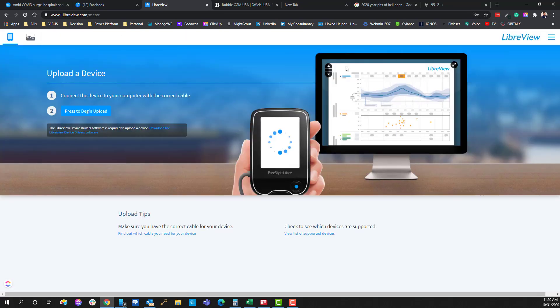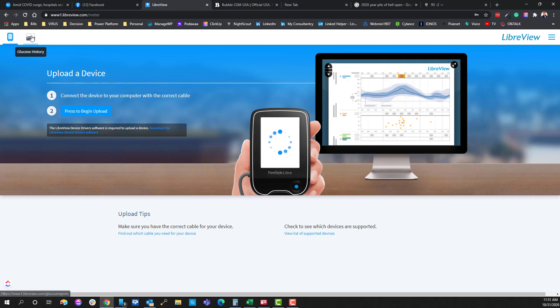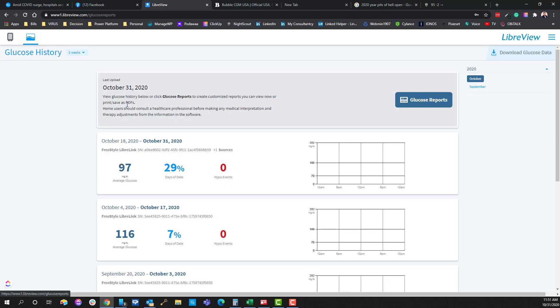And so once you've done that and you've logged in, it'll ask you to connect your Libre Freestyle Reader with a cable to your PC so you can upload the data. Well, with the integration of Diabox and Bubble, you no longer have to worry about doing that. The integration simply will make it all show up.